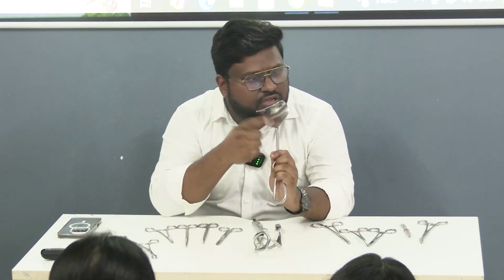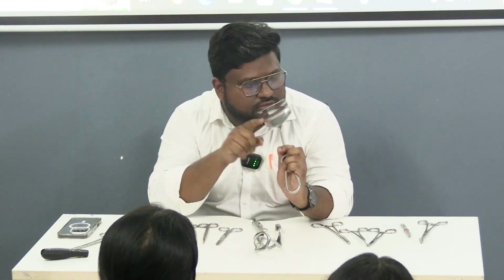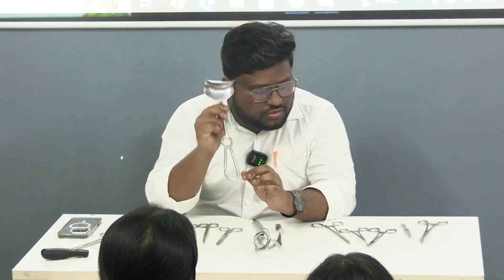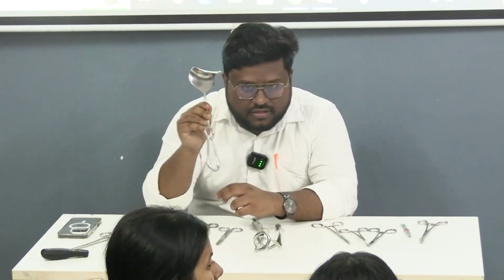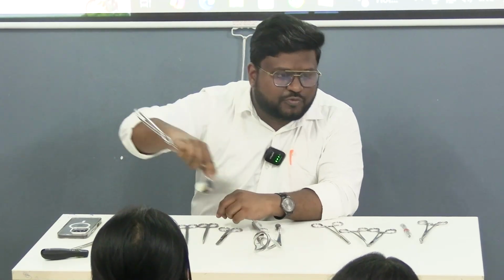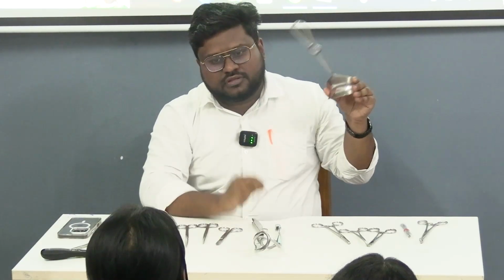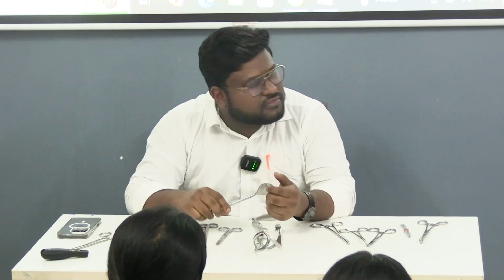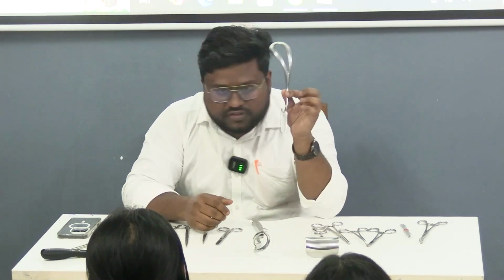Why is this cavity here? এই যে কার্ভেচার কেন আছে? No grip. Why? Where is it gripping? This is to maneuver over the symphysis pubis, যাতে এই ফাঁকে symphysis pubisটা আটতে পারে। This is going to maneuver itself behind the symphysis pubis. Okay? What is this?